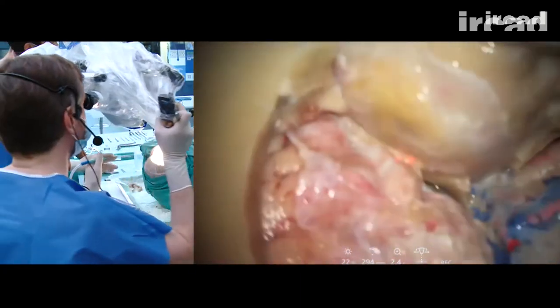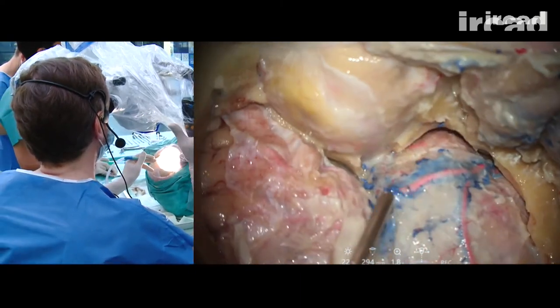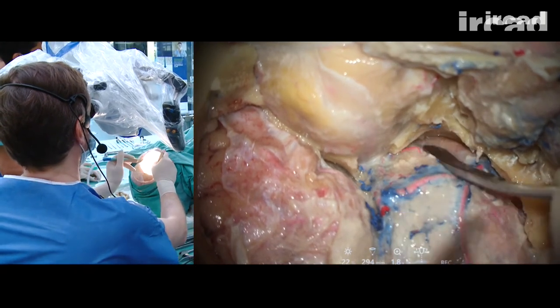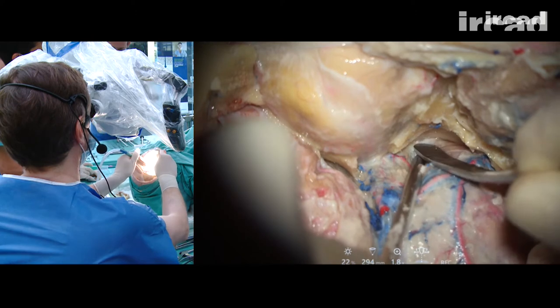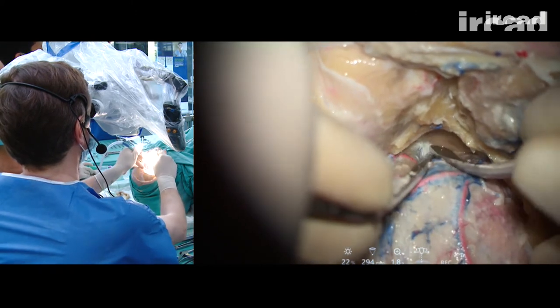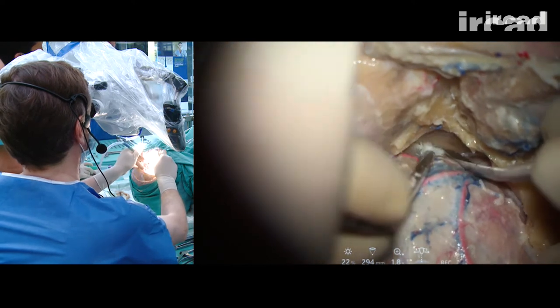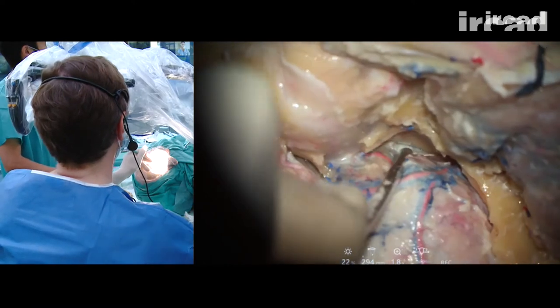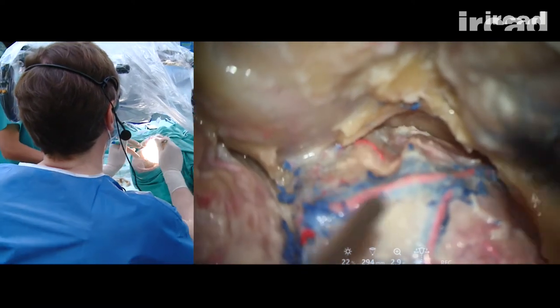Okay, this piece of bone here to flatten my craniotomy downward can be easily removed or drilled. But because we are a little bit in a hurry, I'm not going to do it right now. If I keep peeling here in this direction, I will find progressively V2.